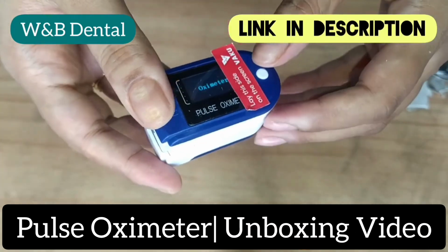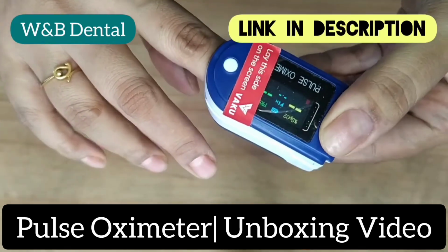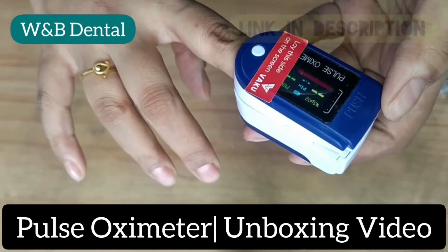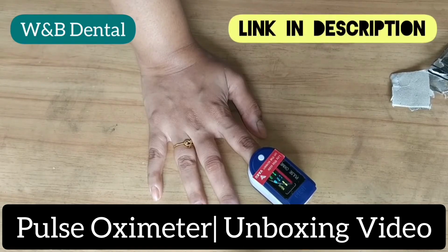Press the power button. Put your finger inside the oximeter. And before seeing the reading, you need to wait for 30 seconds to find your result.